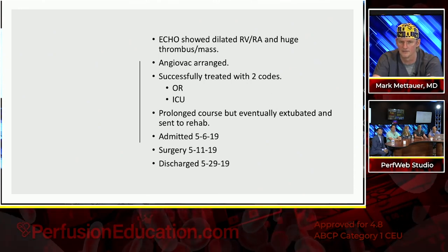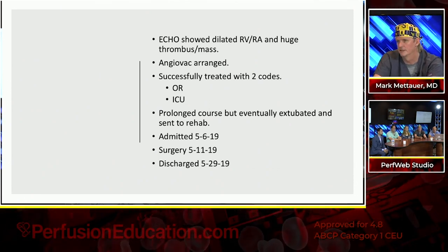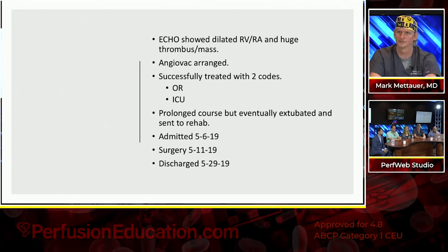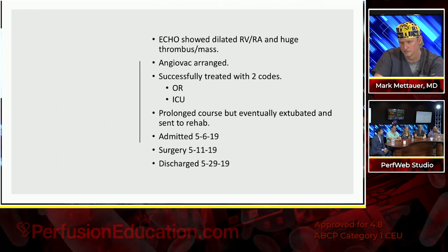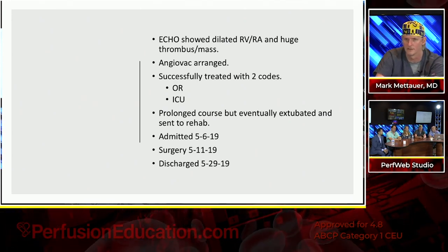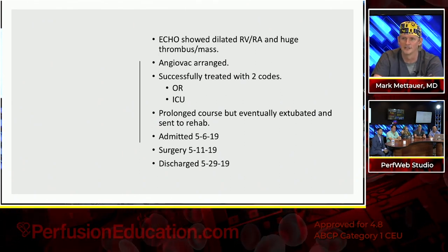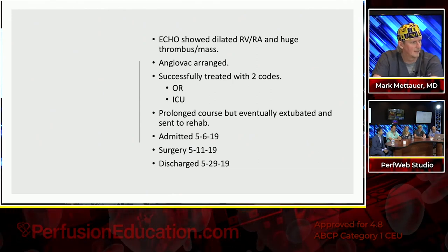And the other reason we did it at that particular hospital was they could not get her transferred downtown. So at this facility, we do hearts and et cetera, and occasional ECMO, but this place, they acted like they were on the verge of an experimental discovery, because they loved it. Because they've never seen anything like this. Especially when, historically, we'd open the chest to do a pulmonary embolectomy or a right atrial, right ventricular thrombectomy. So she was successfully treated. I won't go over the details again. We'll show some slides, how significant this thrombus was and how really exciting, for lack of a better term, and treated successfully.